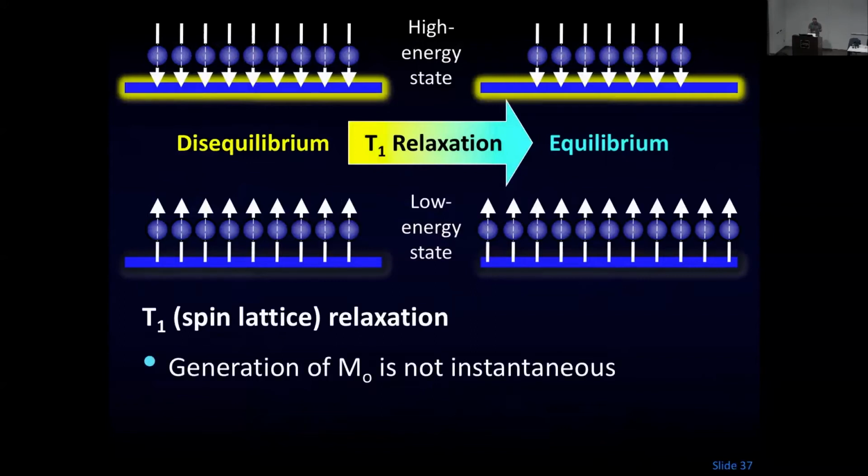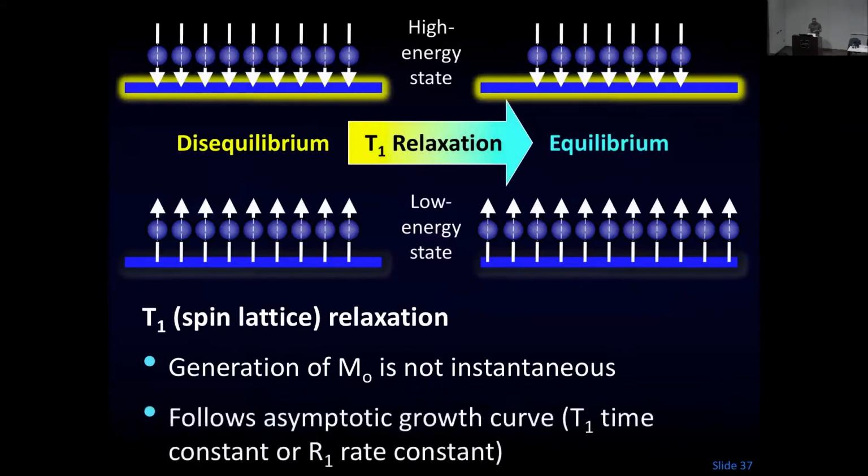Now, T1 relaxation is not instantaneous. It takes a certain amount of time, and it follows an asymptotic growth curve known as a T1 growth curve.